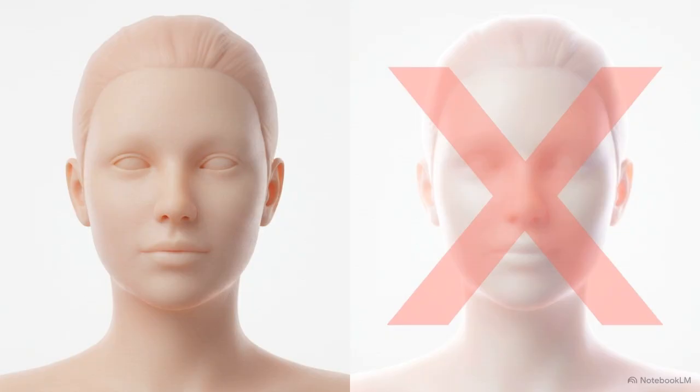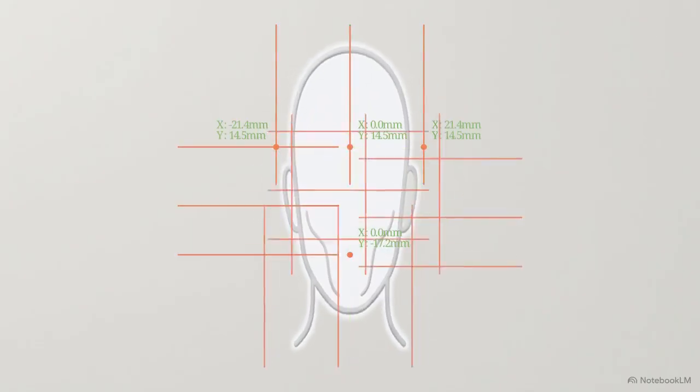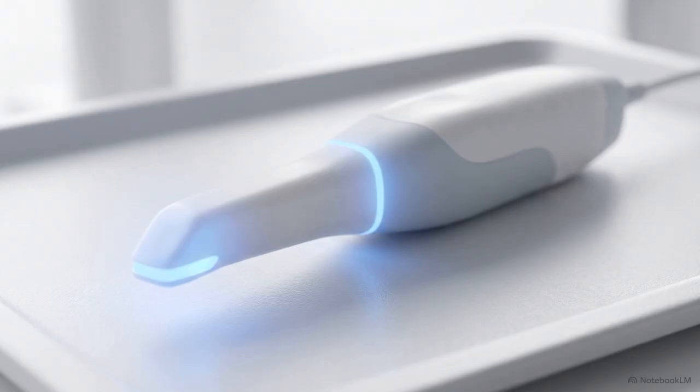But there is a strict rule here. These photos must be completely free of digital filters. Heavy filters and editing apps alter your true facial dimensions. If you feed that distorted data into the system, you actively sabotage the software's ability to map out your genuine proportions.